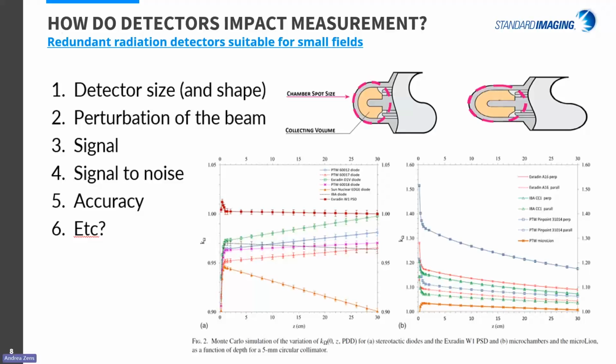Accuracy. So what are those questions? You need to answer questions about the detectors you want to use for those small field measurements, like, does it have energy dependency issues? Does it have angular dependence issues? And what are the implications in different orientations? Are there dose rate or dose per pulse dependencies? What else might be of concern? Leakage, drift, repeatability, resolution. Can it be calibrated?